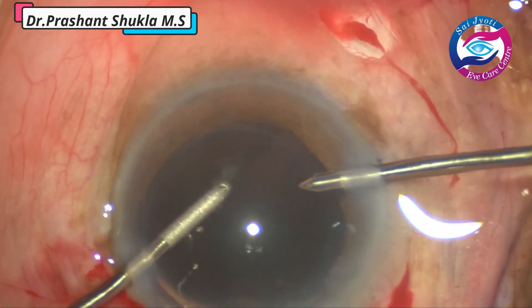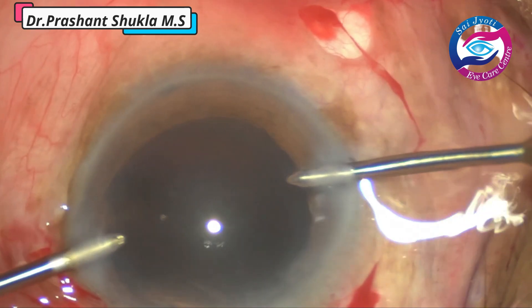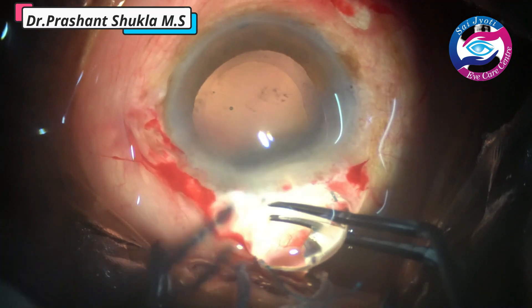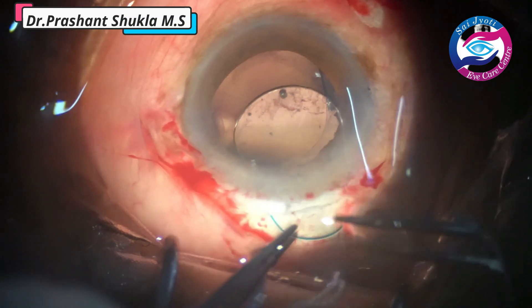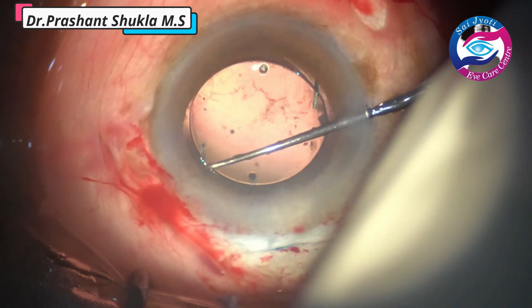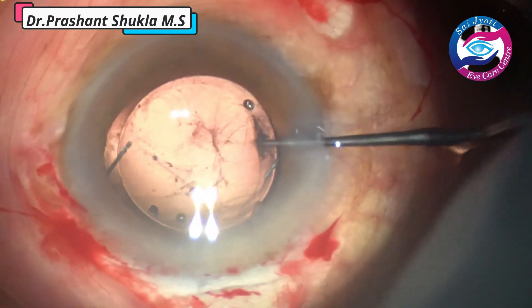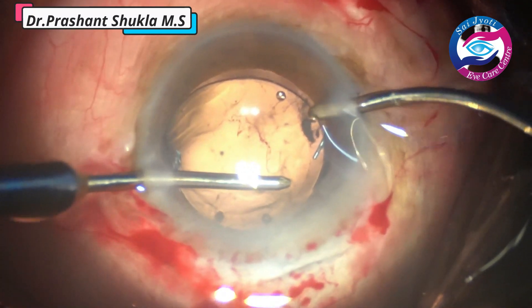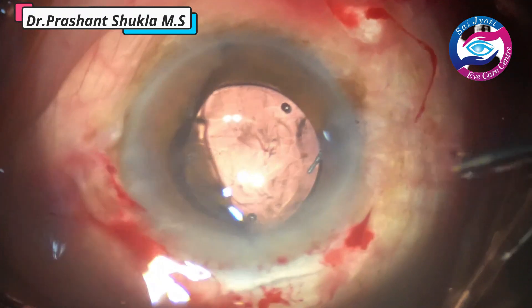We should all be well versed and have access to all the instruments like Simcoe and others. Here I am implanting a 3-piece PMMA lens — just note how we hold the lens and gently push it into the eye. The haptic goes below the anterior capsular margin, and then I am holding the optic-haptic junction and dialing it through the pupil slowly until the lens is dialed into the capsular bag. Now is the time to remove any remaining cortical matter and the viscoelastic pushed in for lens implantation.